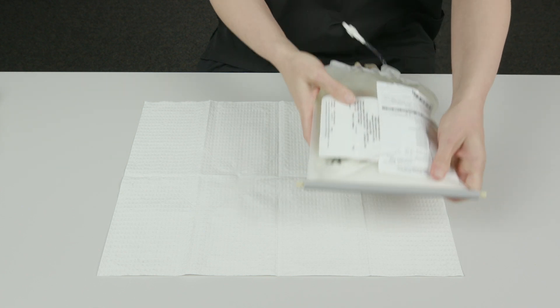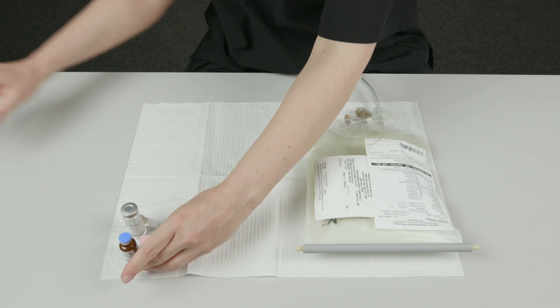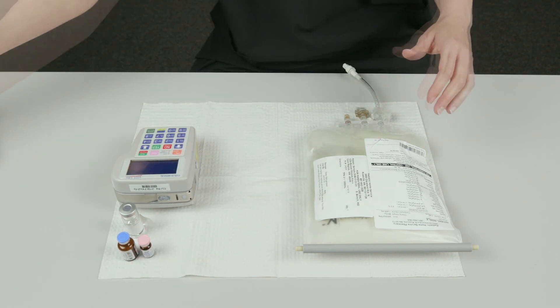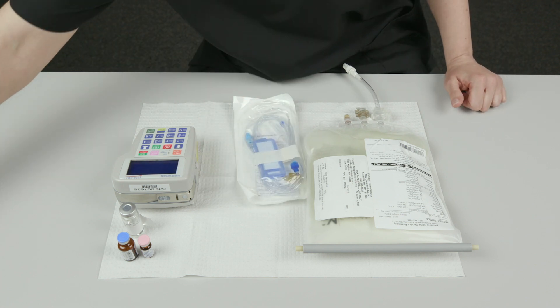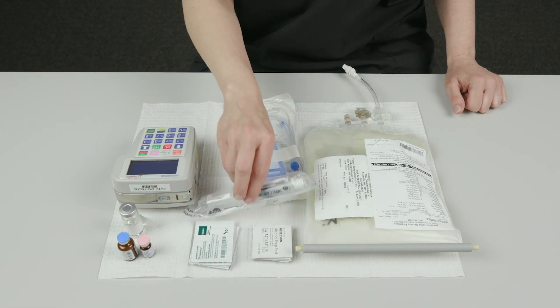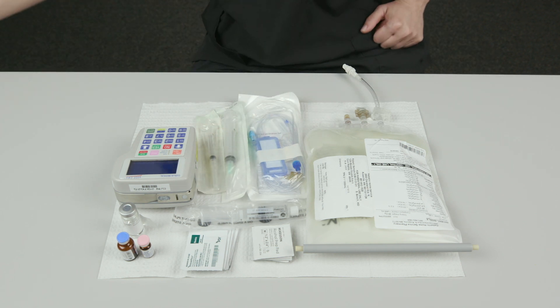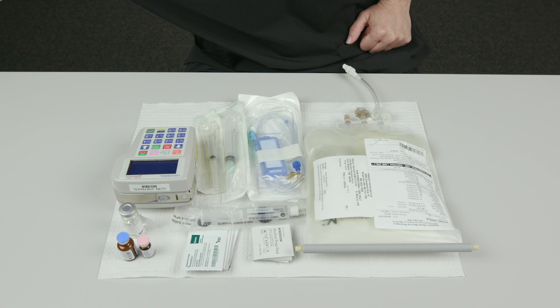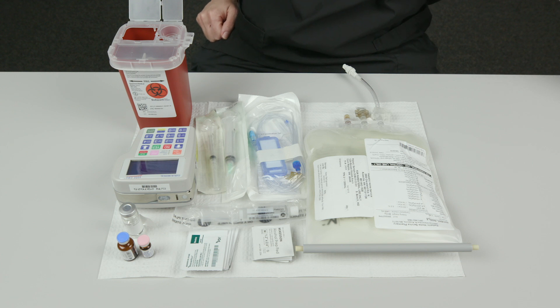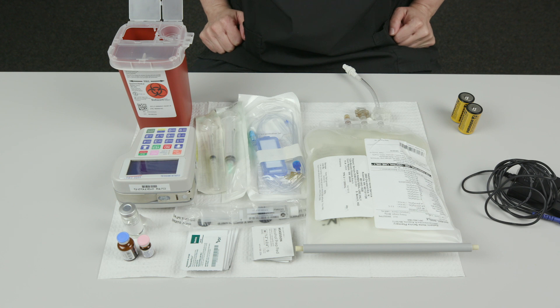This work surface is now a safe zone or a clean area. Put the supplies and equipment you need onto the safe zone: the HPN bag, two vitamin bottles, and medicines; a Curlin 6000 infusion pump; Curlin IV tubing with an appropriate size filter; alcohol pads; chlorhexidine pads; a pre-filled saline flush syringe; empty syringes with an attached needle, one for the vitamin bottles and one for each medicine bottle; and a sharps container. Put two C batteries and an AC power cord, if you'd like to use one, next to the safe zone.